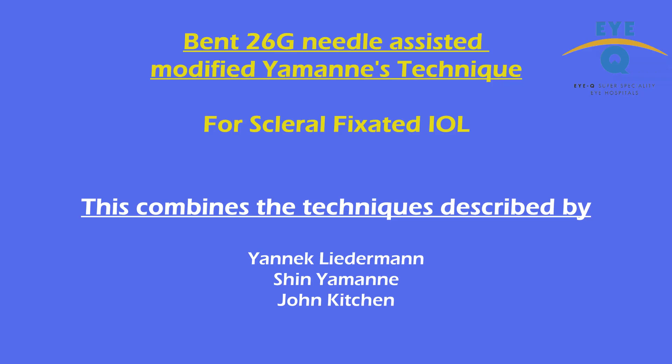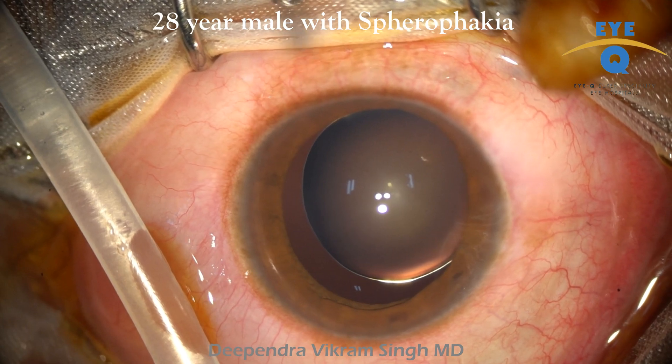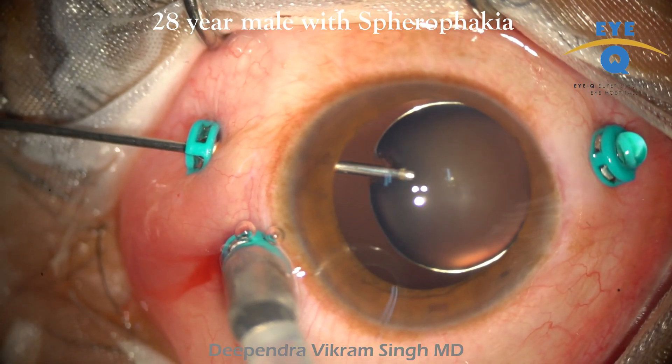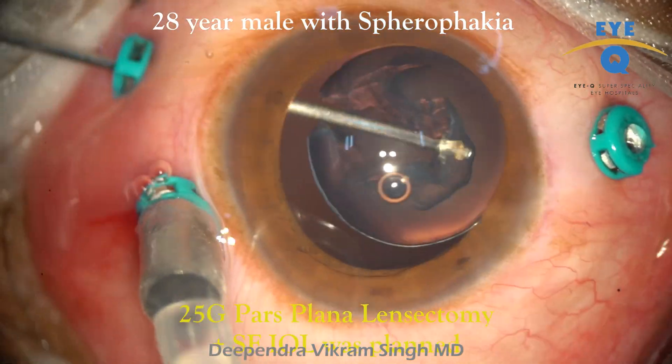This video shares the modified Yamane technique for scleral fixated IOL, which we have been using for more than six years. The background of this technique has been shared earlier in a video uploaded on the AAO website. You can find the link for that video in the comment section.